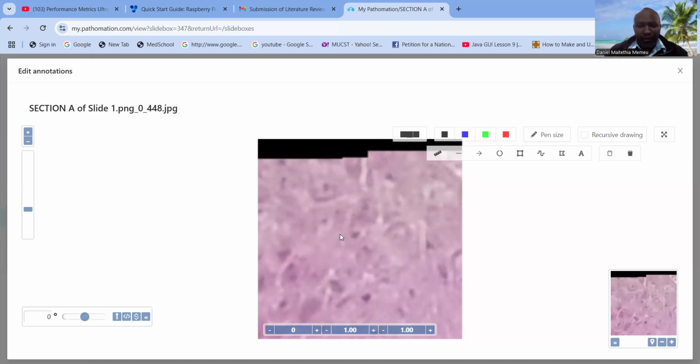If you can see a reason why you want to classify the image as malignant, just label it. Otherwise, label it as benign. So this is just a classification. You give it either a malignant or benign label, because those are the answers we will use to compare the prediction of the AI model that I'm talking about.